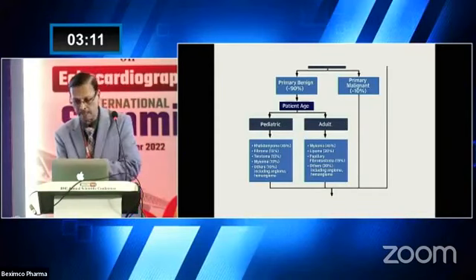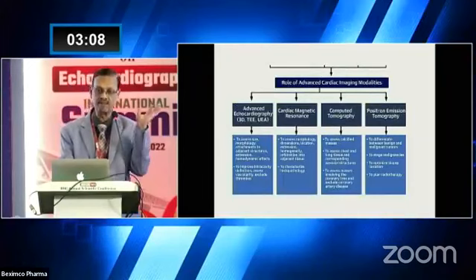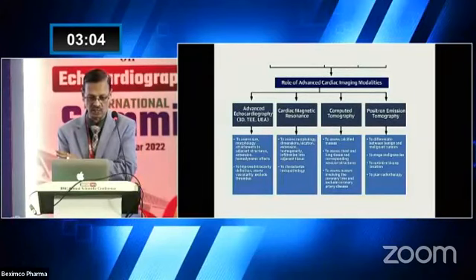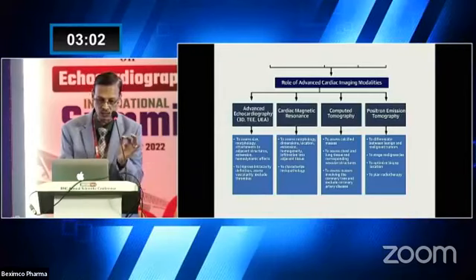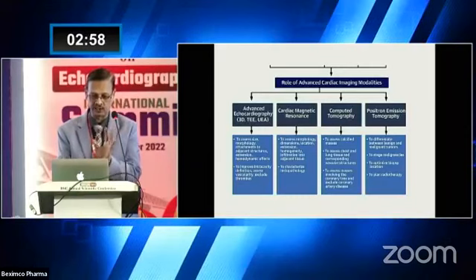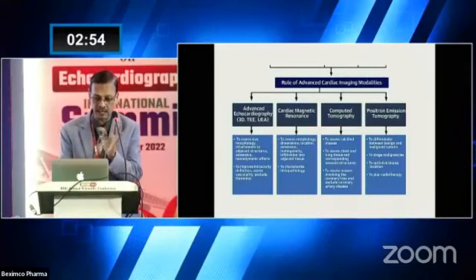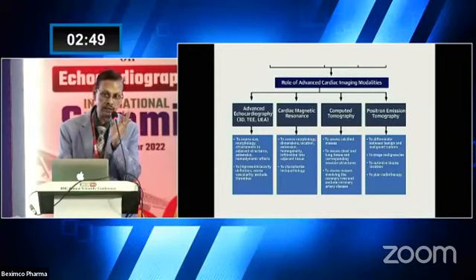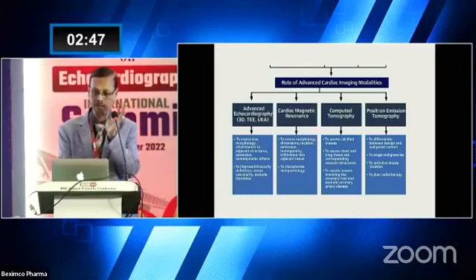If it is a primary malignant tumor, then consider the role of advanced imaging studies, like advanced echocardiography, like 3D TEE, or any other modalities. The most important modality is cardiac magnetic resonance imaging, CMR, and you can do even computed tomography and even PET.